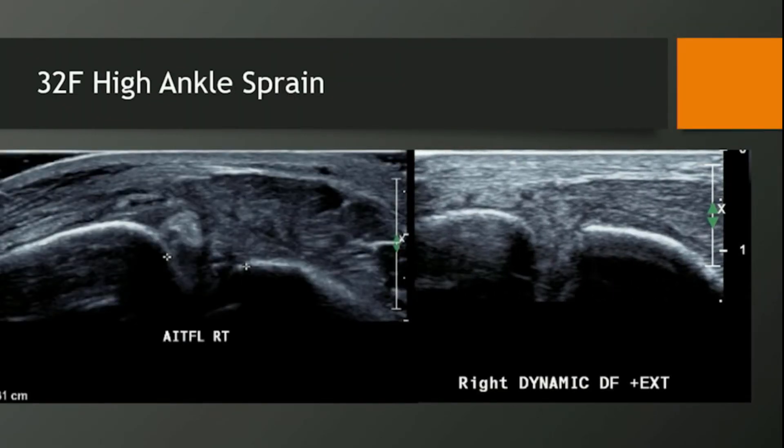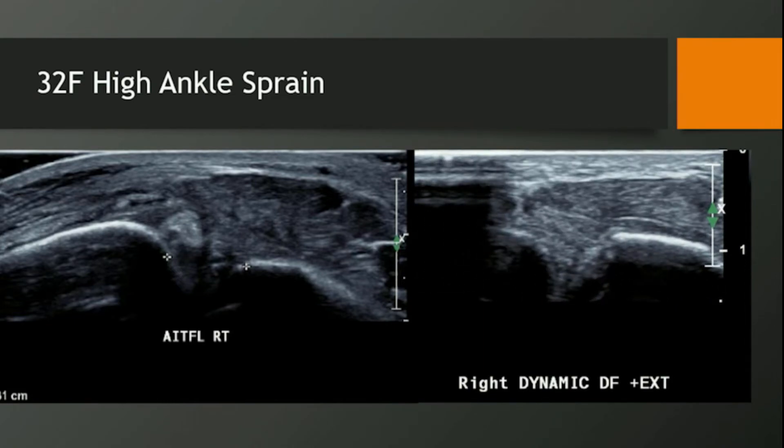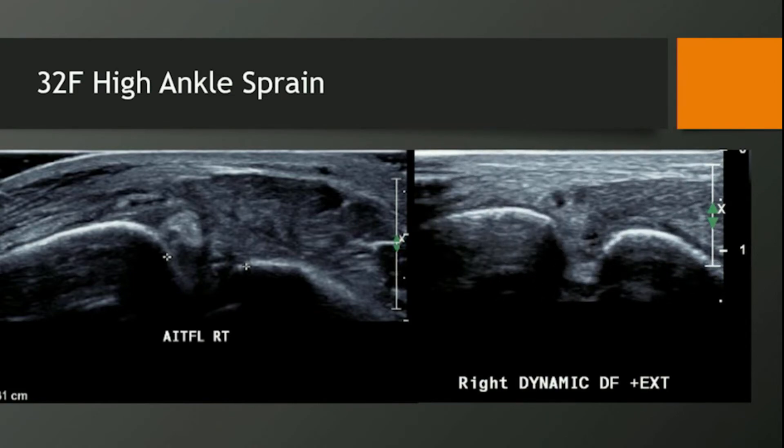The hardest thing is just staying in the same position. Obviously it's quite subjective — you could really mess that up. You probably could. But the best thing to do is to give them a cine loop of going from the external rotation position back to neutral and taking the dorsiflexion off. If you can capture a cine loop, it's probably more effective, and then you can sit on the images and measure it that way.